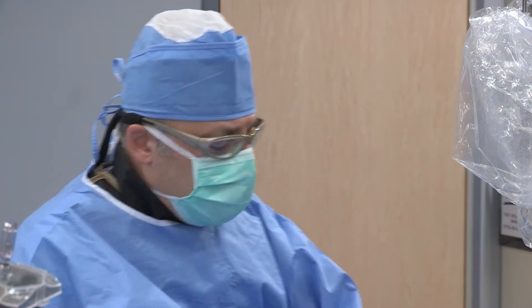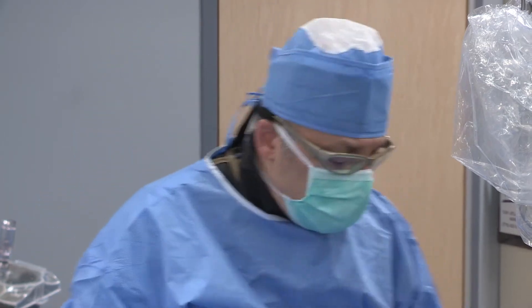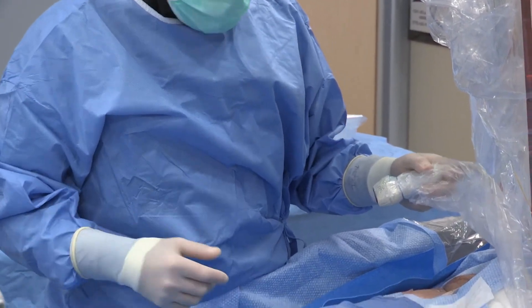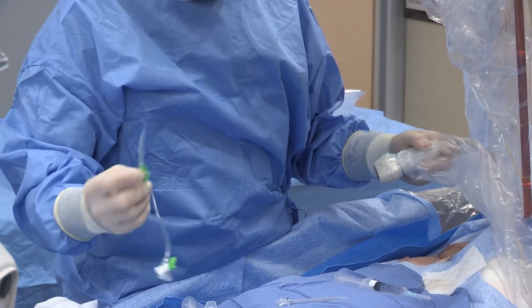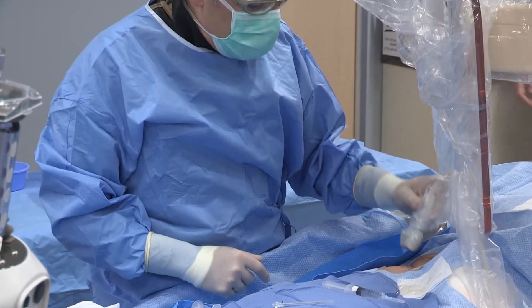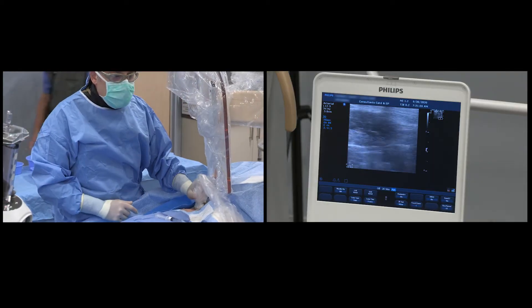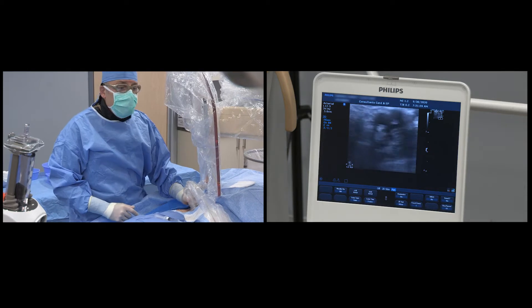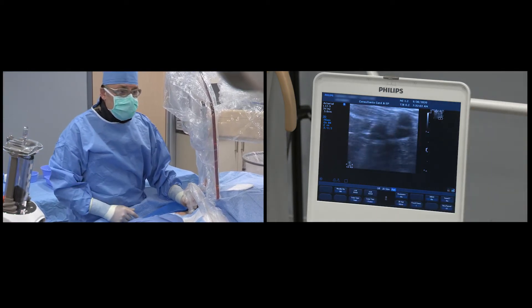We will begin with our ultrasound. We are going to utilize a micropuncture technique with a micropuncture sheath — specifically a Toremos 6-French micropuncture sheath. Our ultrasound technology is a Phillips system, and we are going to define the anatomy utilizing ultrasound.